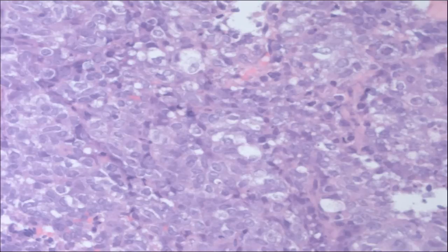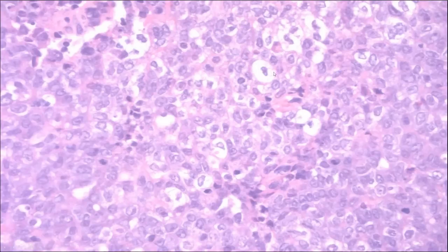So if we looked around a little bit further, there were some things that began to give us clues as to what we think could be going on, and we had these cells with some clear cytoplasm. Here's just another area, cells with clearish cytoplasm, some with the nuclei pushed off to the side. And so that began to shape the differential a little bit more, which we'll talk about.